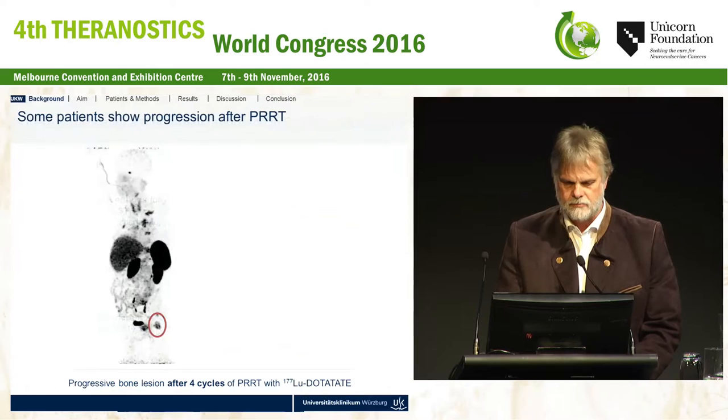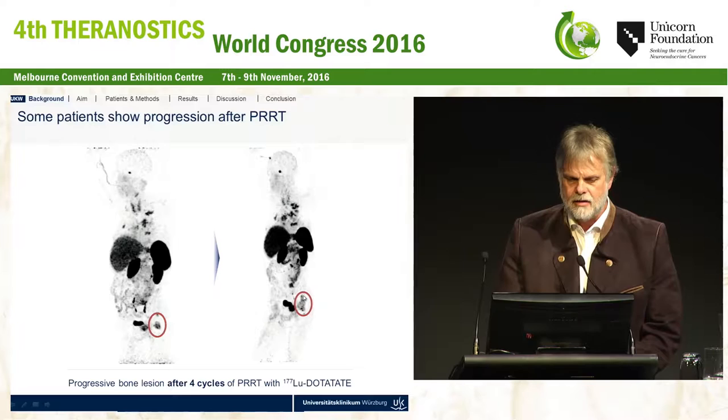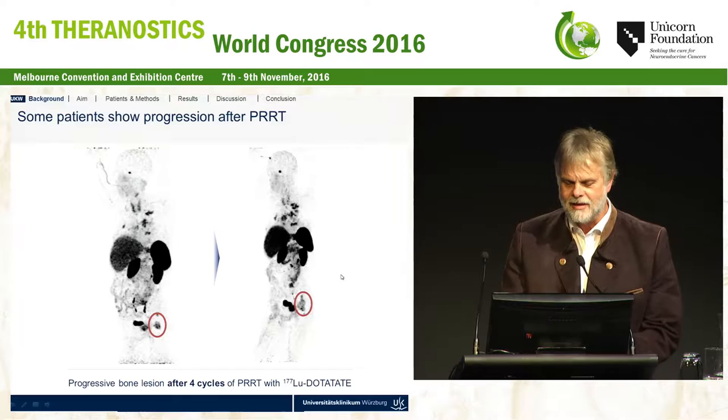Here I just show you one example. You've probably seen this also in your daily practice. You have a patient here with a progressive bone lesion after 4 cycles of PRRT, Dotatate. And you still see in the Dotatate scan that you have uptake in the lesion, and that means the treatment was not as effective as it could have been or should be. Also, we can talk in this aspect, of course, about personalized treatment, but this was done with standard activities.